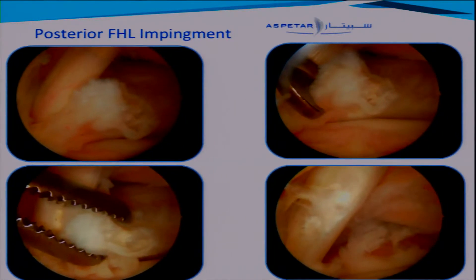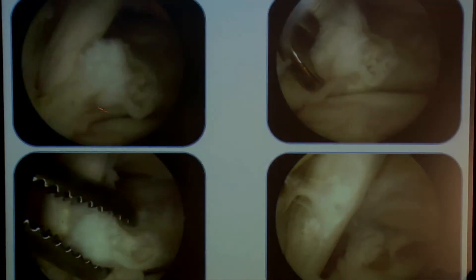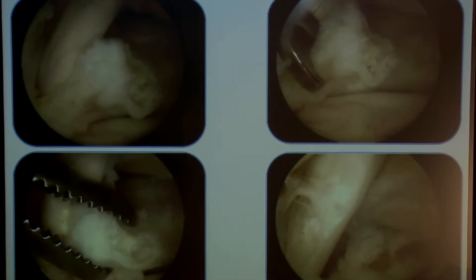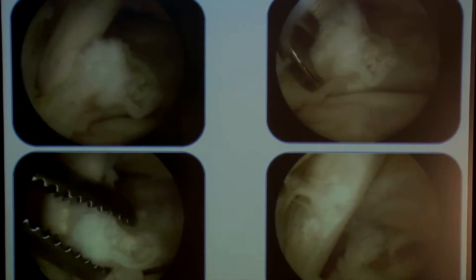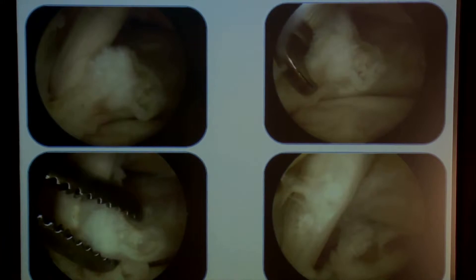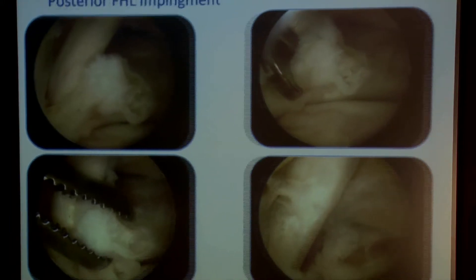Looking at arthroscopic images, we start by localizing the FHL — the flexor hallucis longus — and see the bony impingement onto the tendon, which can be the trigger for the posterior impingement problem. If we release it from its attachments and ligaments and remove it, cleaning off the whole area no longer impinging on the tendon, you can clearly see the adhesions and impressions on the tendon corpus, confirming a bony conflict onto the tendon.